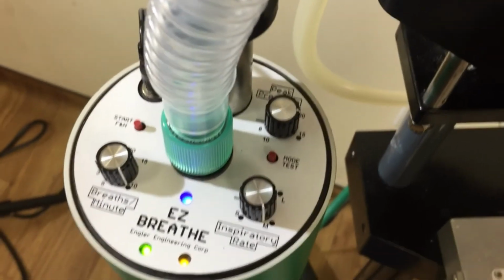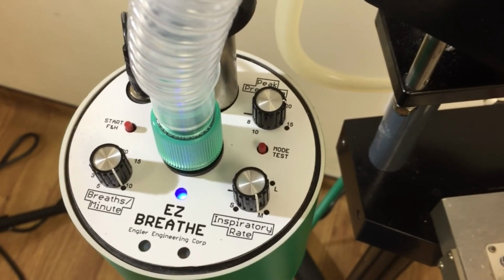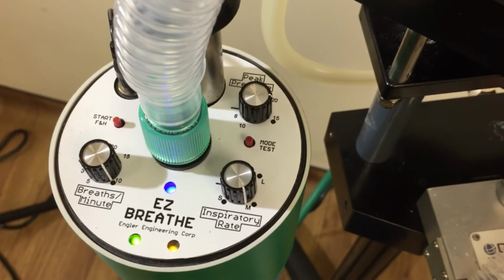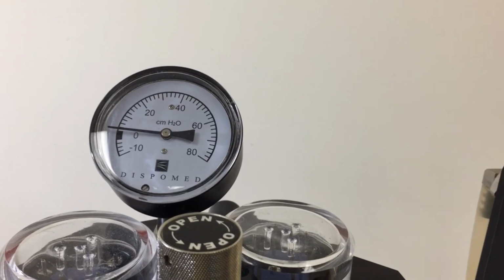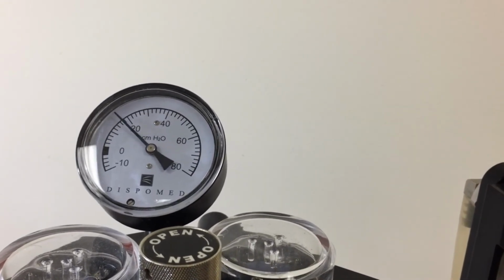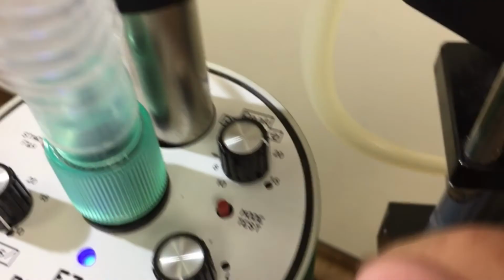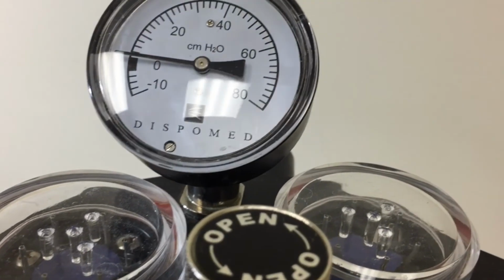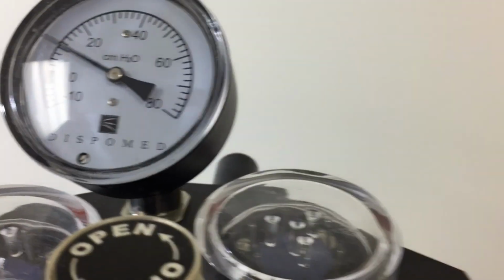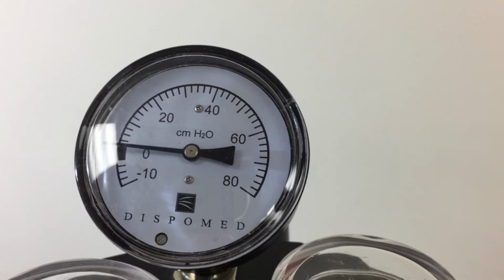Peak pressure control. The peak pressure control adjusts the peak inspiratory pressure that the ventilator goes to. As you can see, the manometer goes up to about 15 and the inhalation ends and the patient is allowed to freely exhale. If I change the peak inspiratory pressure to 20, we can see that the peak inspiratory pressure will now go up to about 20 before cutting off.